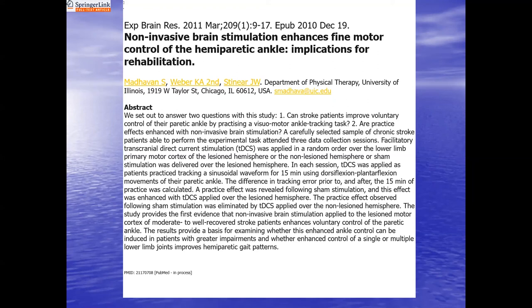I haven't talked about pulse EMF. It's one of the newer applications. The FDA approved it as a device primarily because they thought you couldn't do any harm with it. It was a way to stimulate the brain, but it can't evoke a potential. You can't make somebody wiggle their fingers or toes. As far as they're concerned, it wasn't something that could actually do something to the brain. But we know better than that.